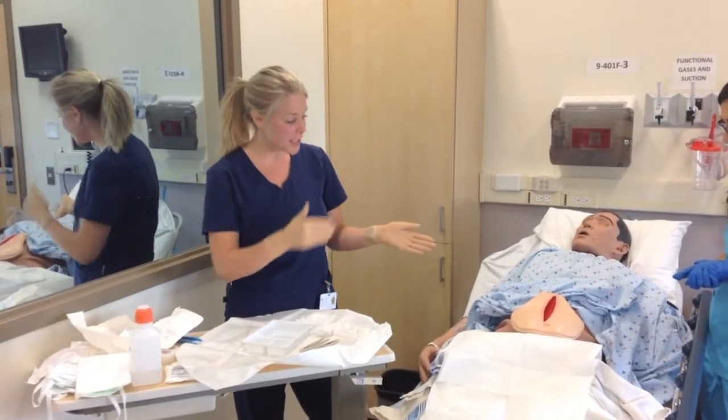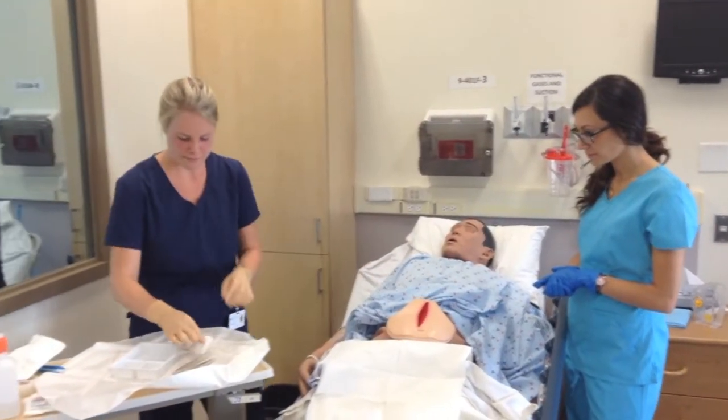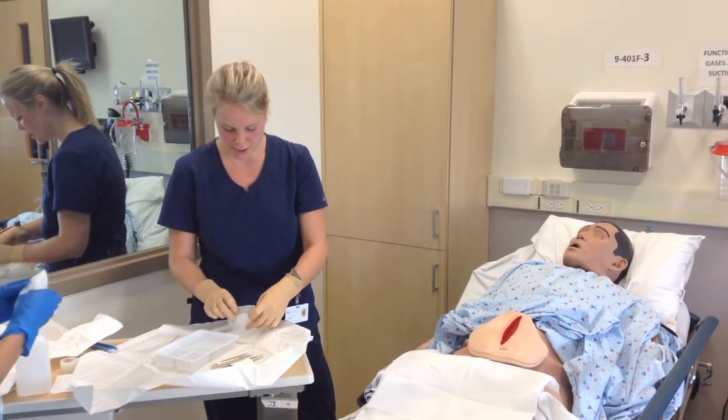Now we're just going to clean the outside of the wound. And we're grabbing a new one every single time. And we're just going to dry this off now.